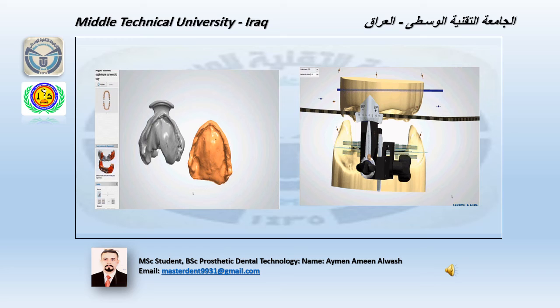Scanning the primary impression of the upper and lower jaw, and then we scan the impression bonded around the centric tray. After that, the value of the UTS device is used to orient the primary digital model position on the virtual articulator.